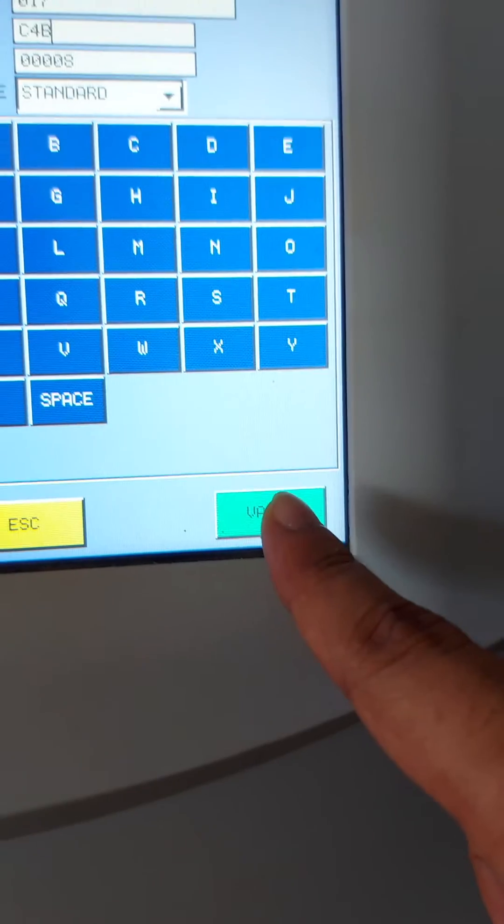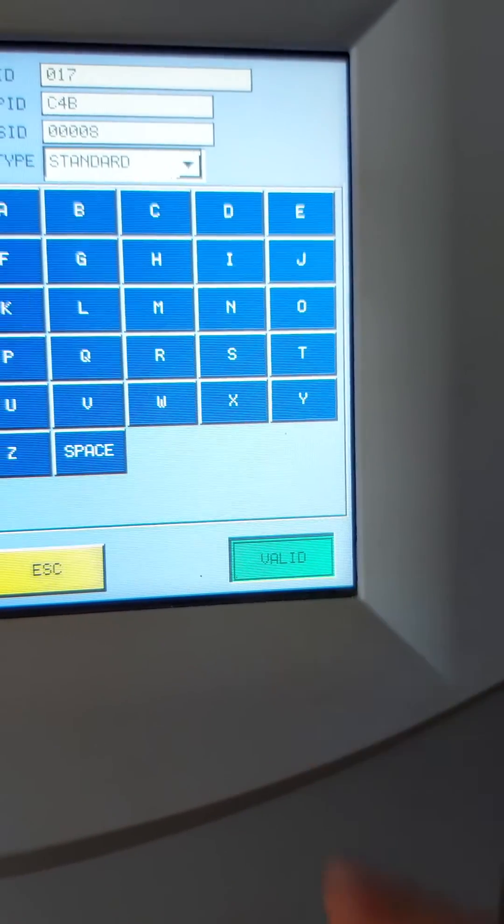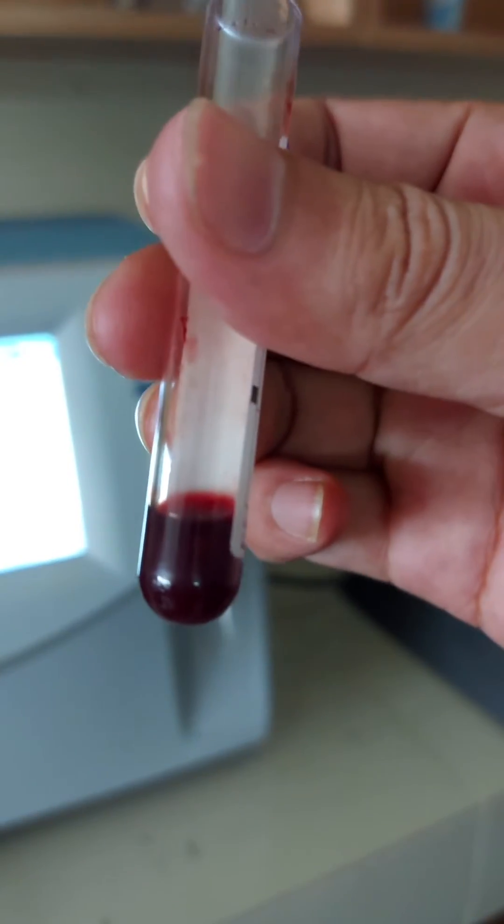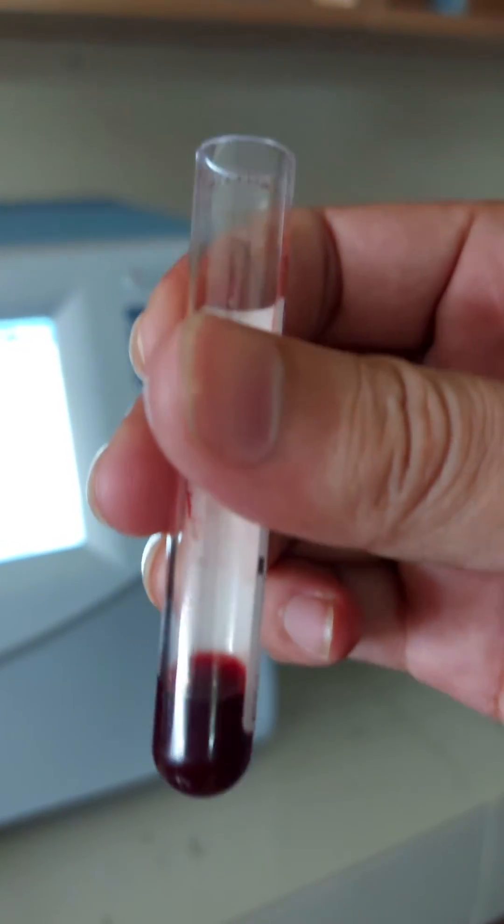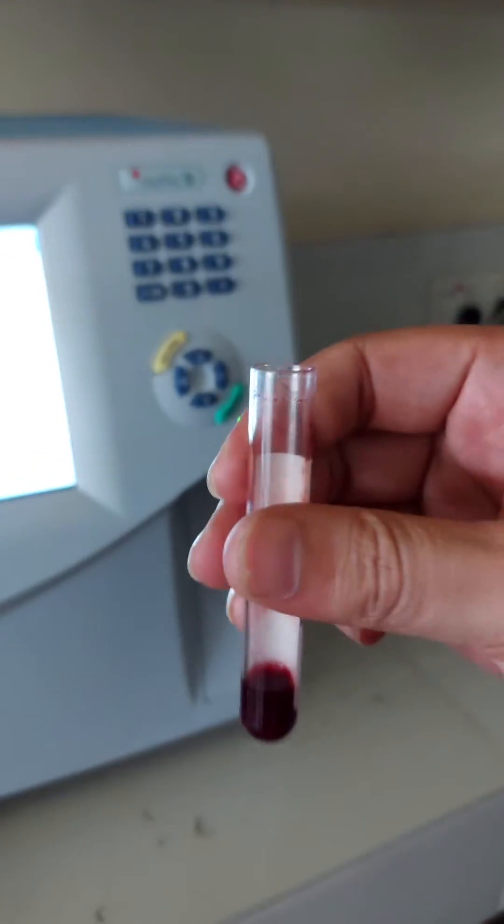And our PID number, which is the sample number, was C4B. Now we press the valid button. The machine is ready to take the sample now.